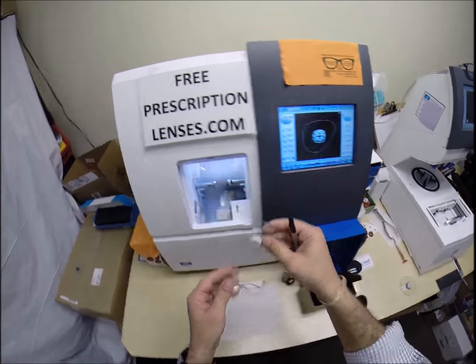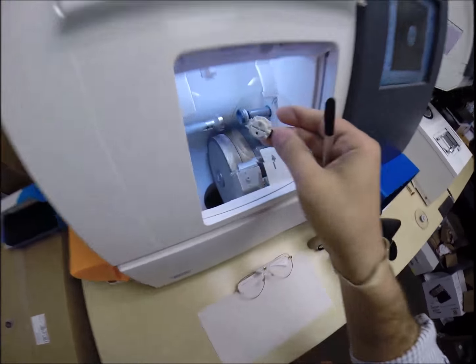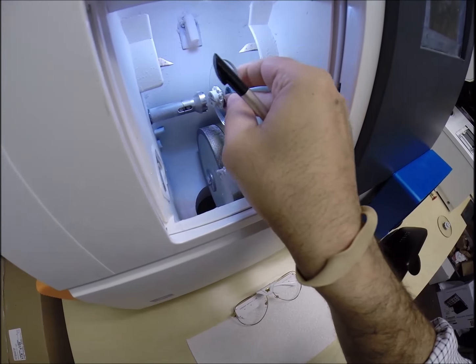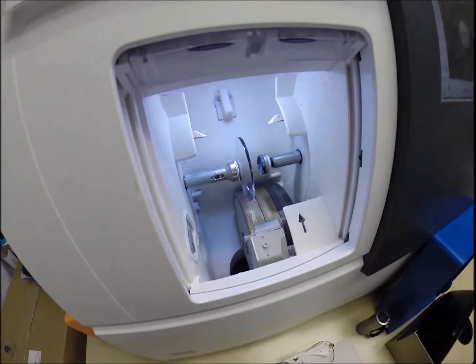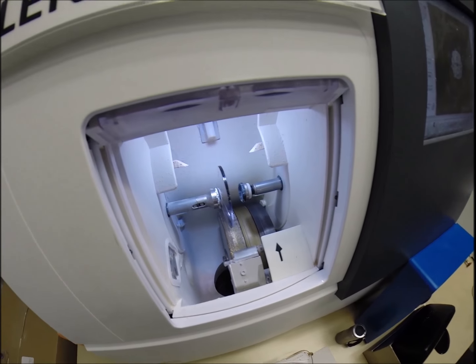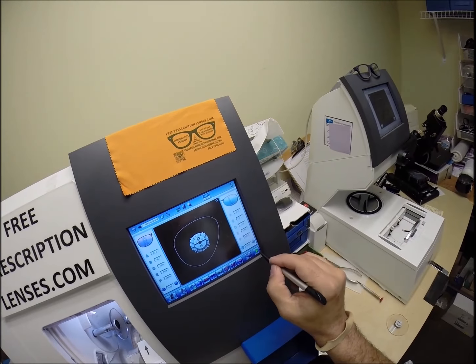Press that on there firmly. Now the magnet's going to do its job a second time today. It's going to attach itself to another magnet there in the chuck, or as I like to call it, the Charles, because I don't know this machine well enough to call it Chuck. I know, you've heard it before, you're going to hear it again.